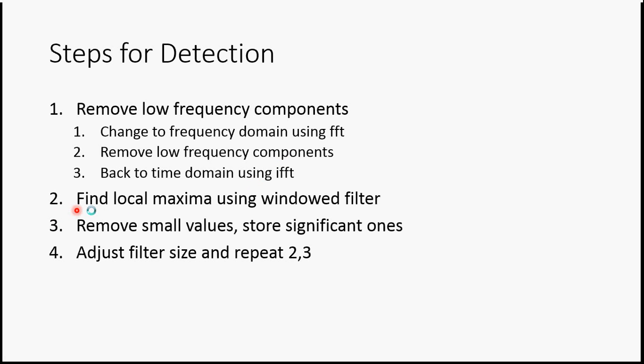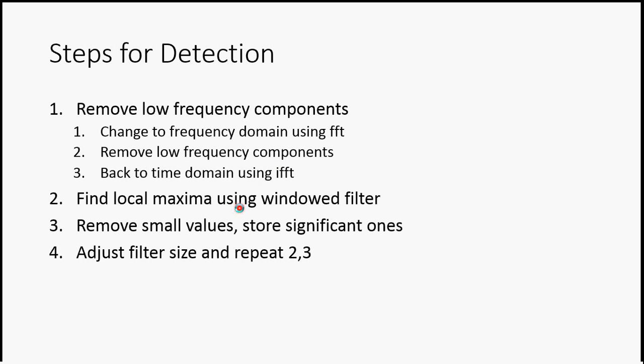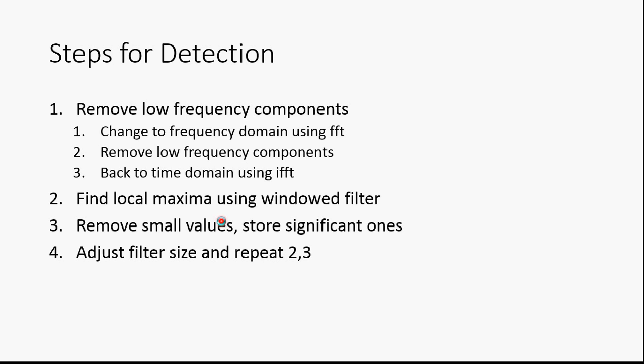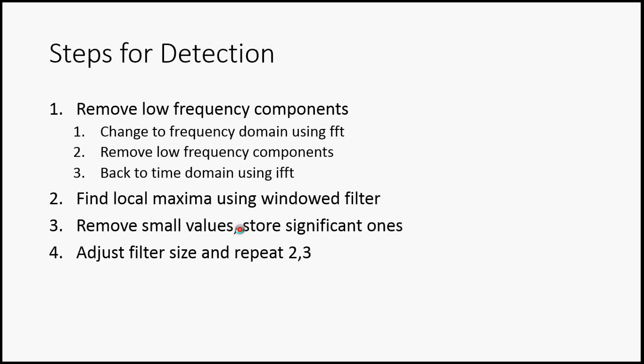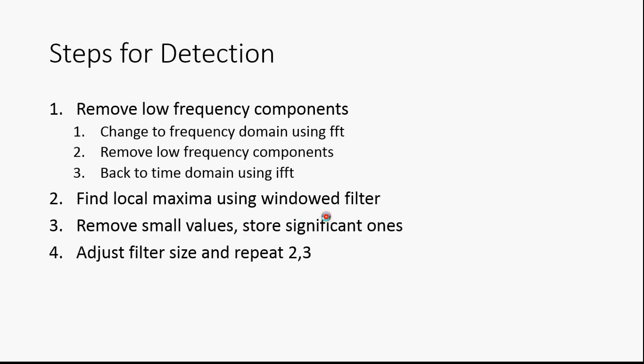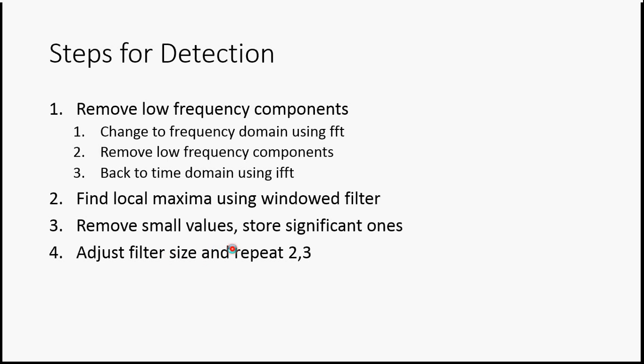Step 2: Find local maxima using windowed filter. Step 3: Remove small values, storing the significant ones. Step 4: Adjust the filter size and repeat steps 2 and 3.